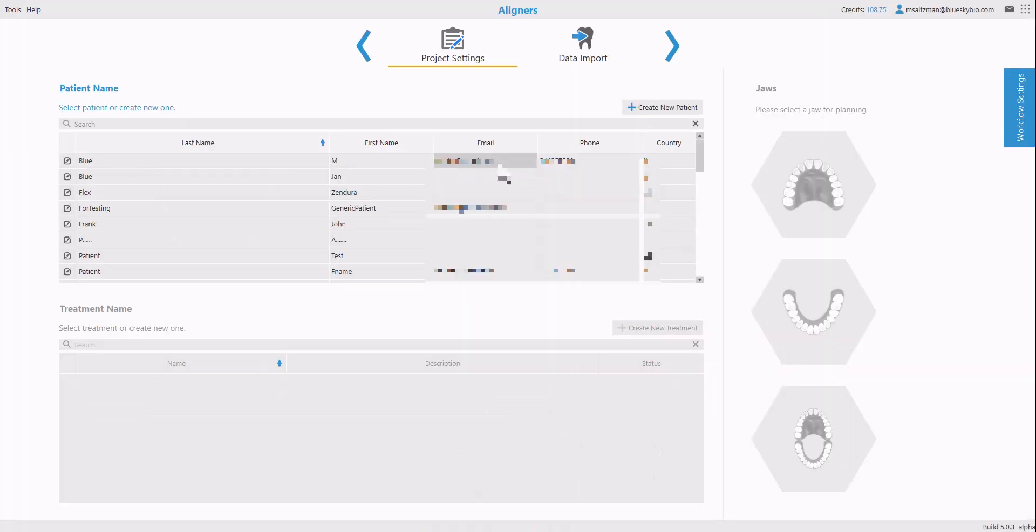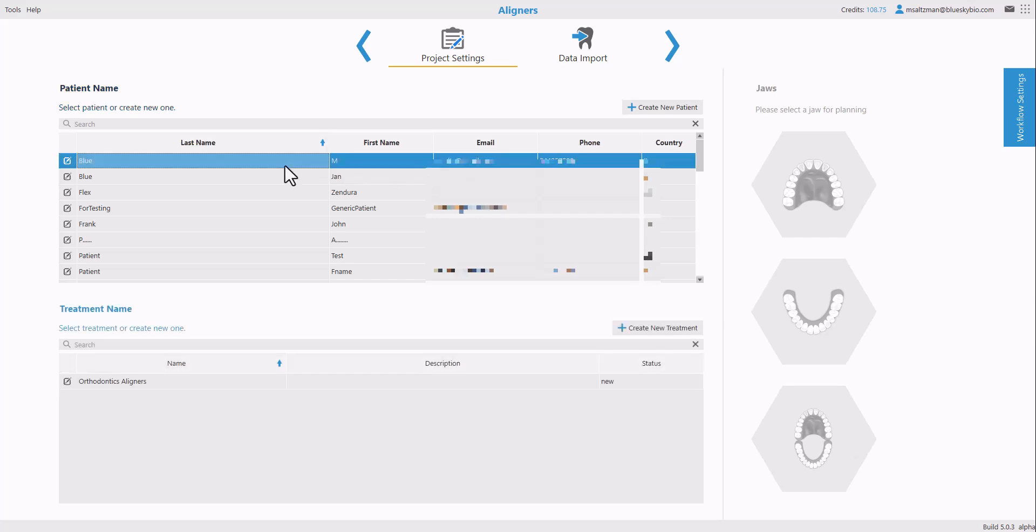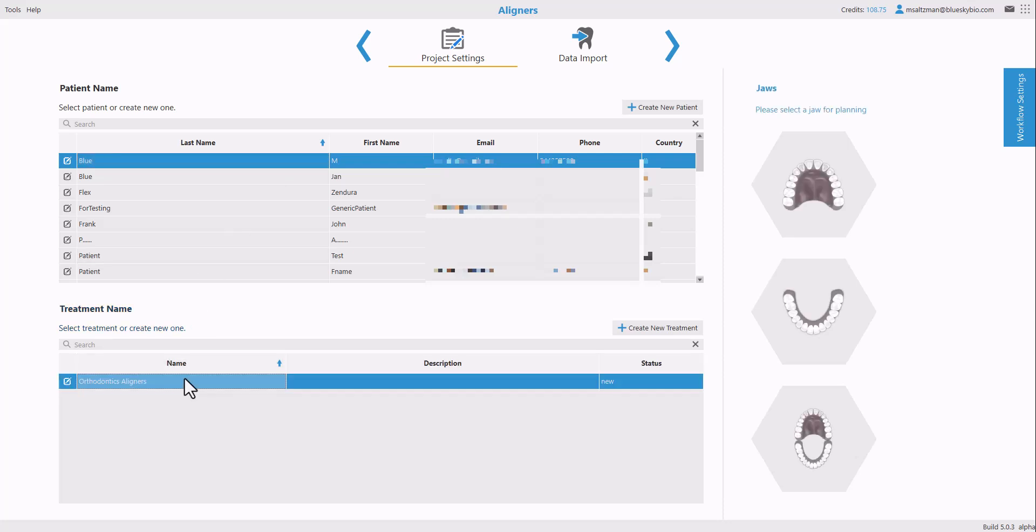All data across all our digital platforms is now organized by patient treatment. So we're going to start the process by selecting the relevant patient and selecting the relevant treatment.